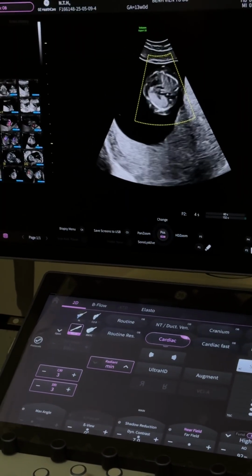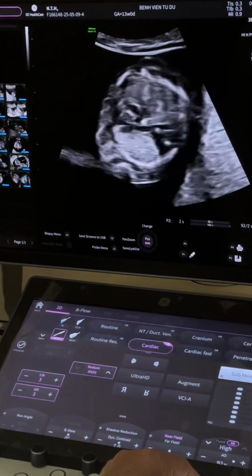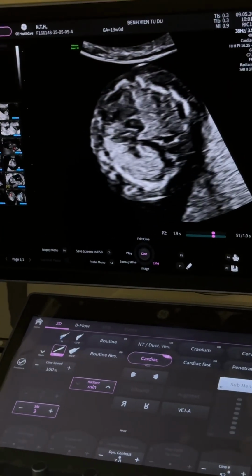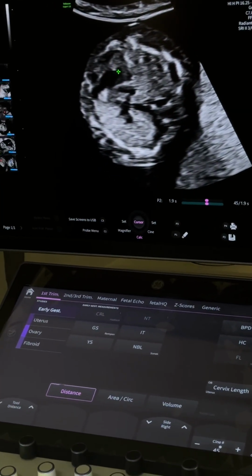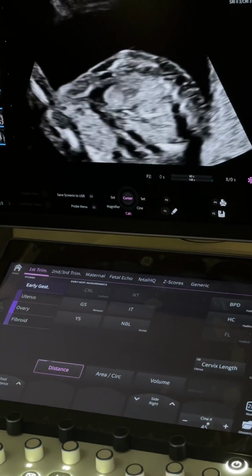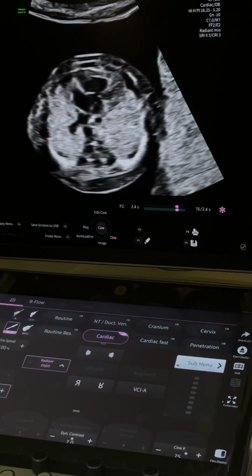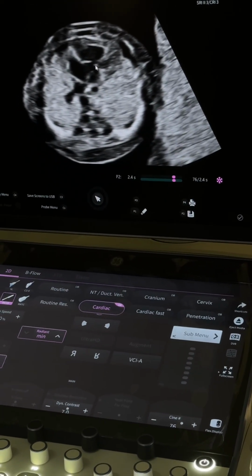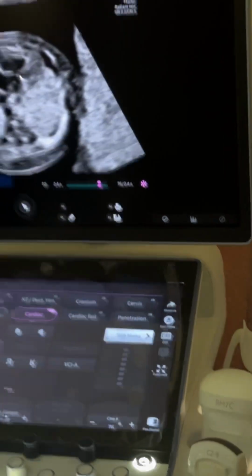Let's try again. So what I'm beginning to wonder is whether there's a central AV canal defect, not just a VSD. So this here is the VSD from here to here, right? We saw that on color Doppler. What I'm trying to work out is is there a central AV canal defect? So if you look at here, it looks like a common valve. So this to me looks like an AVSD just here coming across. When you see that, remember to press this cine loop on it.